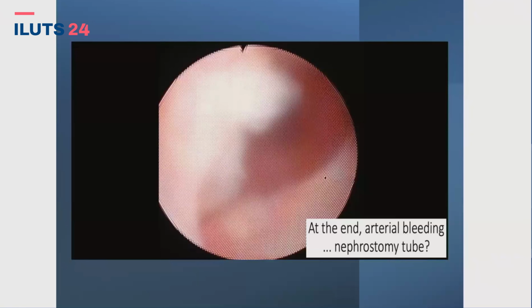The question is good. Goumas. So I would try to coagulate because it's a bleeder. The nephrostomy tube doesn't have any coagulation properties. You can just follow the patient. But if you see something bleeding, you can coagulate it with a laser, for example. Giorgio. Yeah, I saw you were using a high-power Holmium laser from Quanta. You put it into the coagulative mode, and you just coagulate the vessel with your nephroscope.